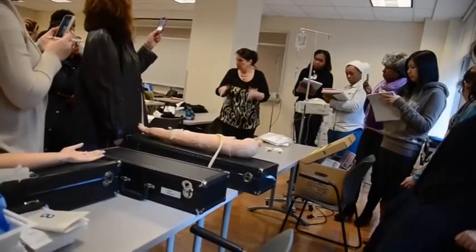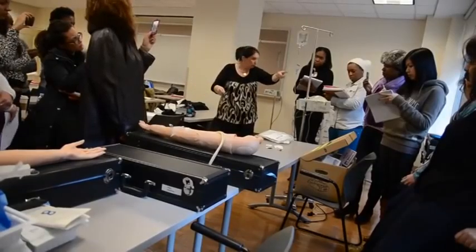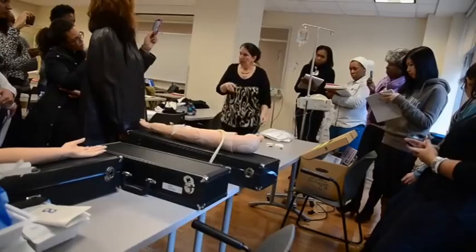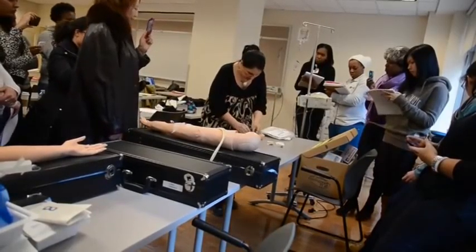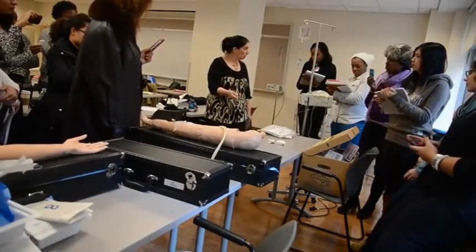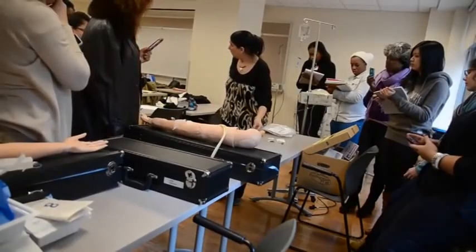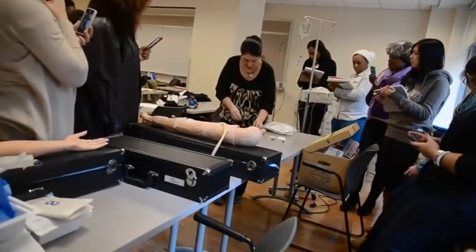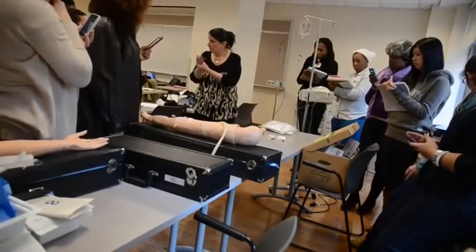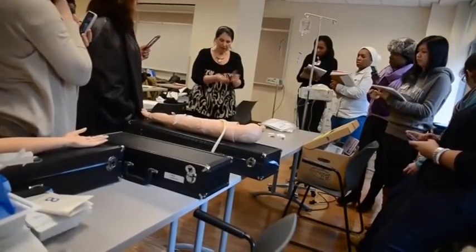So now we say at the same time, your IV went in. You're not opening it up, so you're pretending. Close it. Now I come back in. I realized I didn't open it, but I caught it. So I had to open it. Now I'm going to close it — the IV's done. Close it. Wash my hands, do everything you're supposed to do, and now disconnect it.